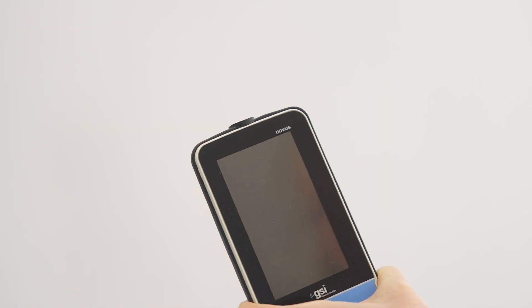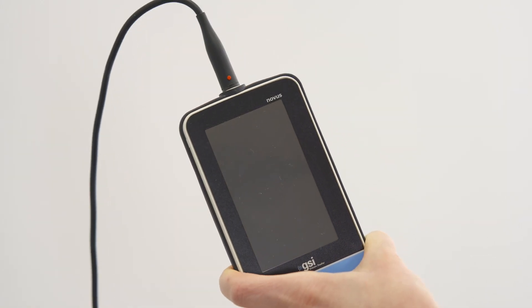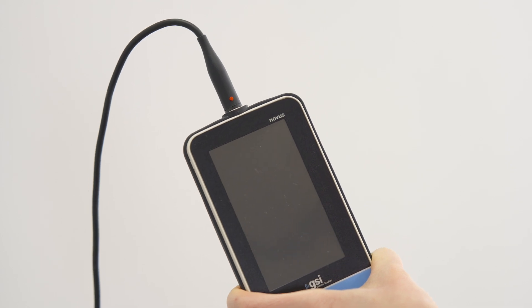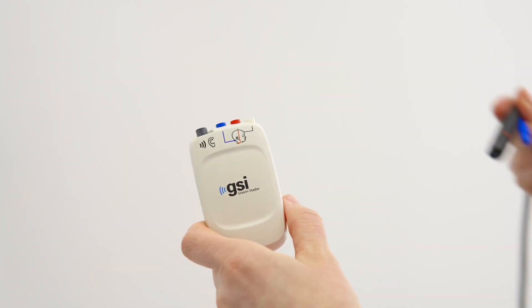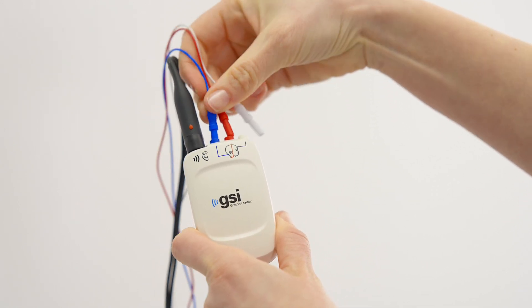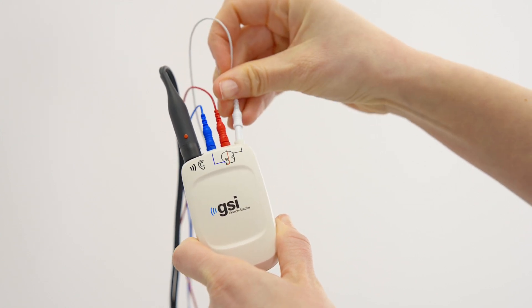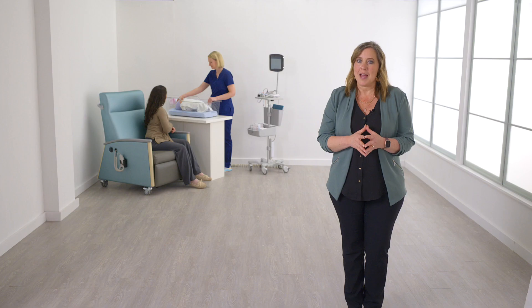Connect the preamplifier to the Novus by aligning the red dot on the cable to the red dot on the connector socket at the top of the Novus. Then plug the transducer — probe or insert earphones — to the preamplifier with the red dot facing up. Finally, connect the red, white, and blue electrode lead wires to the same color sockets on the preamplifier.